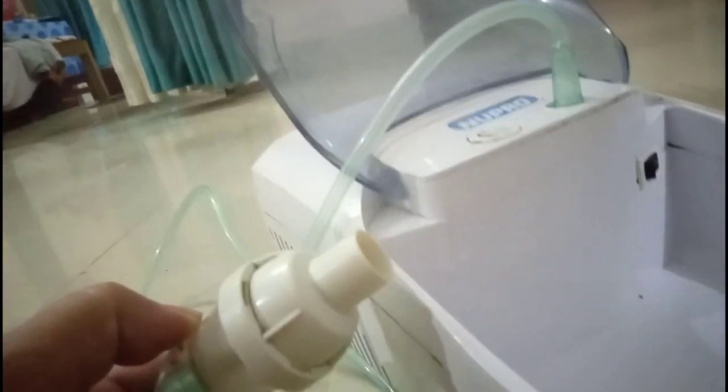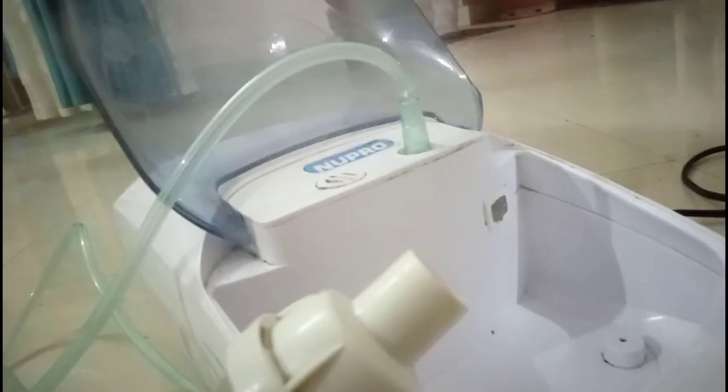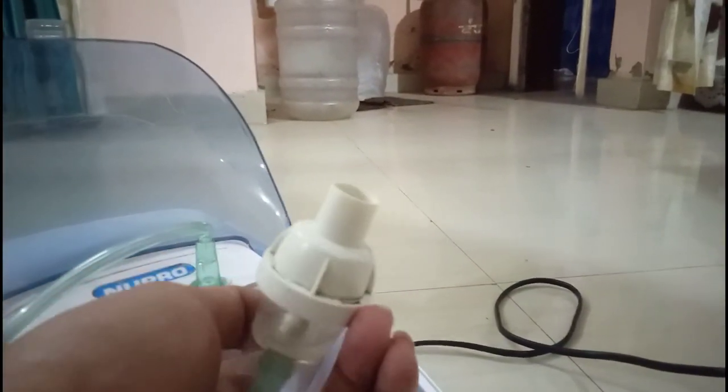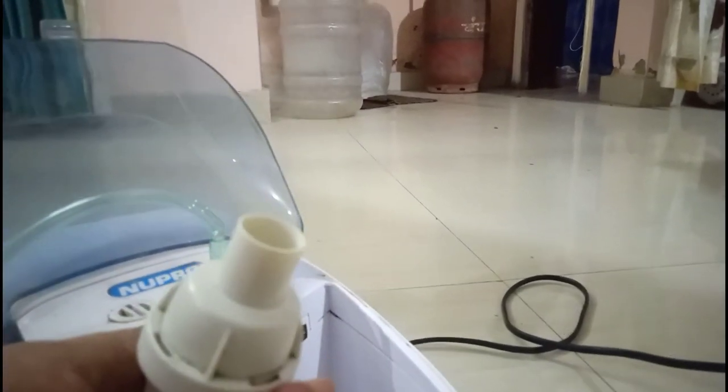In the case of adults, there is no need to use normal saline. Now we will connect the electricity wire and switch on the machine. The duolin becomes a fine mist and will go directly into the lungs through the nose and dilate the airways.